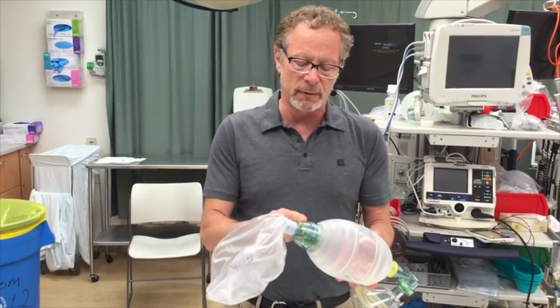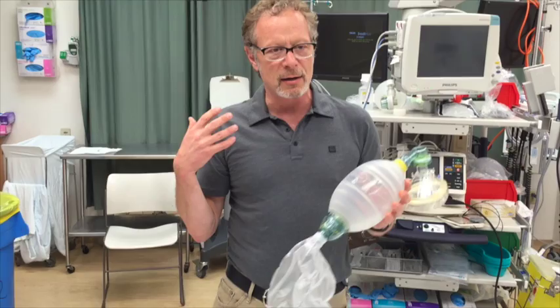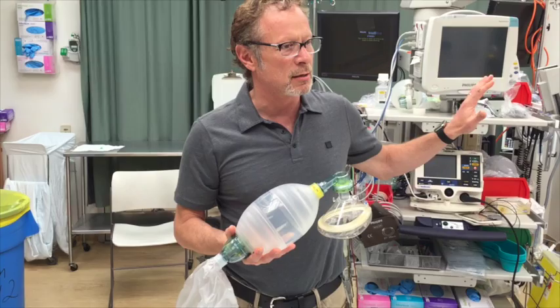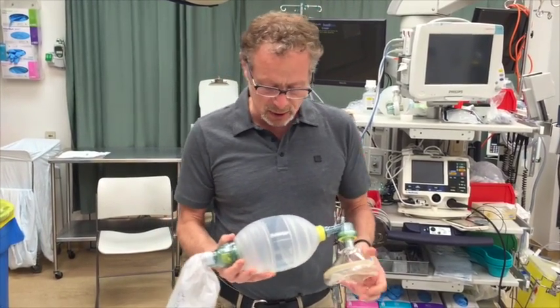You'll always entrain a little bit from these safety valves in the back — they do allow inflow. As long as your minute ventilation is less than the flow you're supplying from the wall, you should be able to give close to 100% — probably in a range of about 95% — with this system.